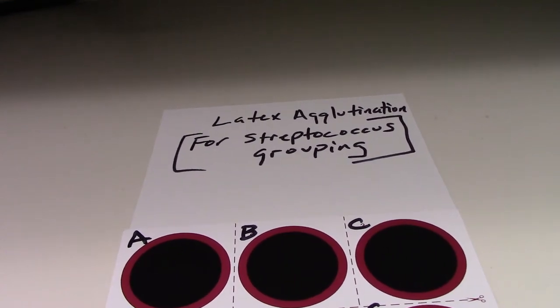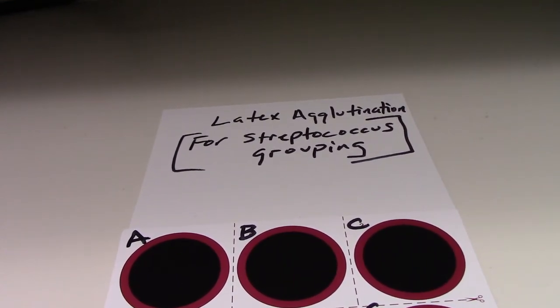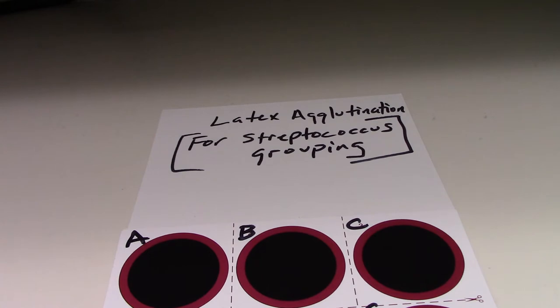The testing being performed is a latex agglutination for streptococcus group antigens. For those group antigens, we will be looking for whether it's streptococcus group A, group B, or C.